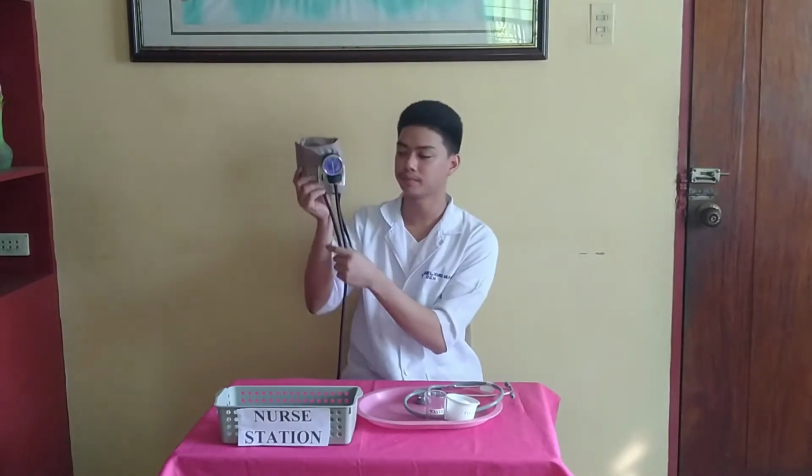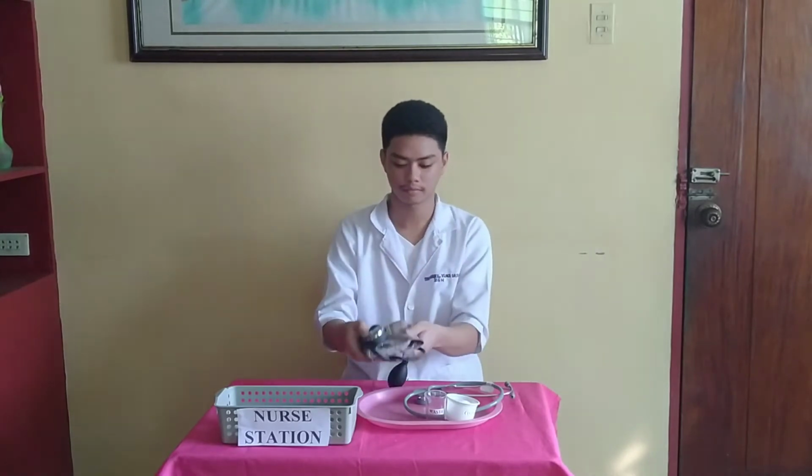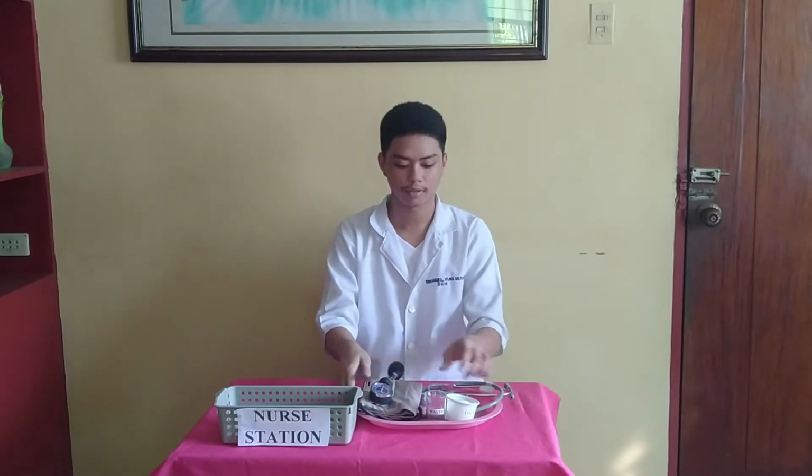For the planning for these procedures, we must assemble the equipment and supplies that we will need. The equipment and supplies that we will need in these procedures are first, the stethoscope, next, the blood pressure cuff, and the sphygmomanometer, and lastly, alcoholized cotton swabs.